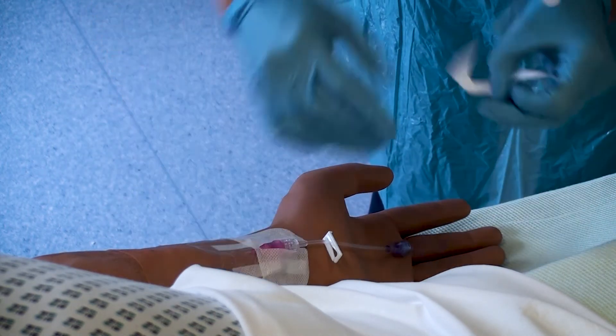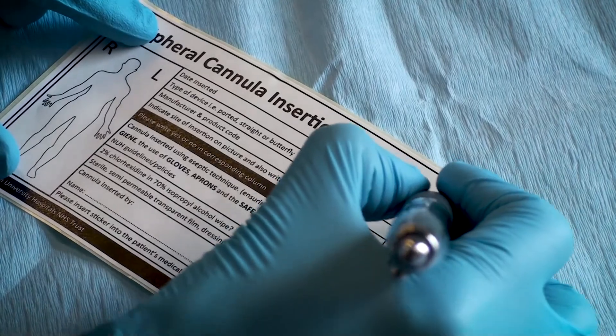Ensure that you complete the appropriate documentation to go into the patient's notes. Ensure that the patient is okay and explain any complications that they may encounter.